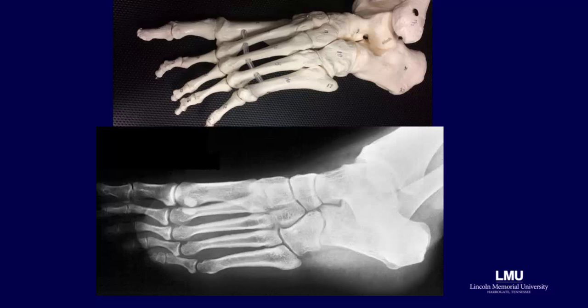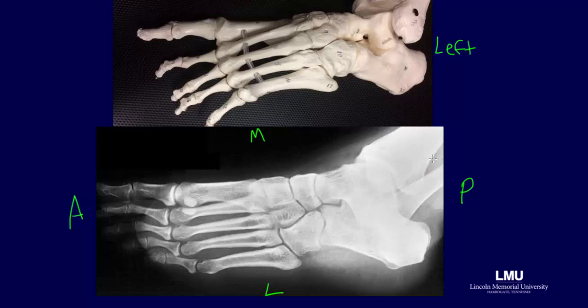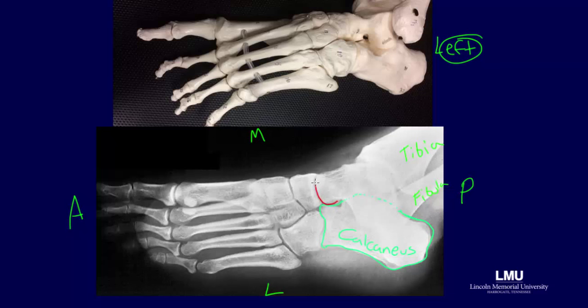Now let's consider an AP oblique view of the foot. Again, we have to establish anterior and posterior, medial and lateral, and we will assume we are looking at a left foot. The first bone that can be noticed is the calcaneus, which makes up the heel. While we cannot get good visualization of the calcaneus from an AP view, an AP oblique view or a lateral view will help visualize it. The other bones of the ankle — the fibula, tibia, and talus — can also be seen in this view. The talus is shown in red on both images.